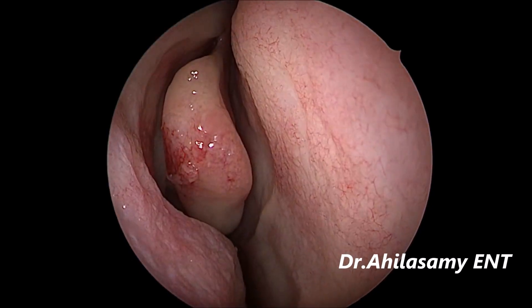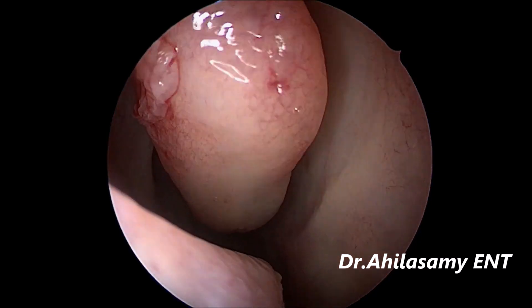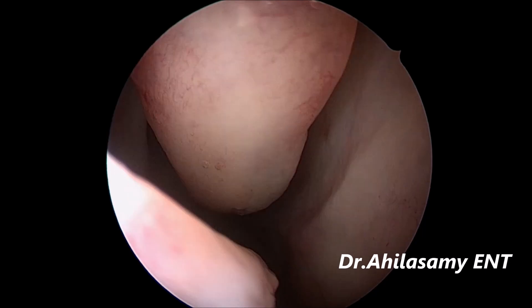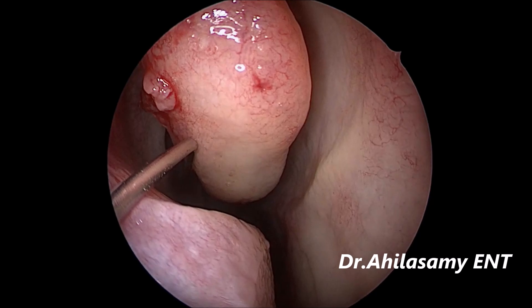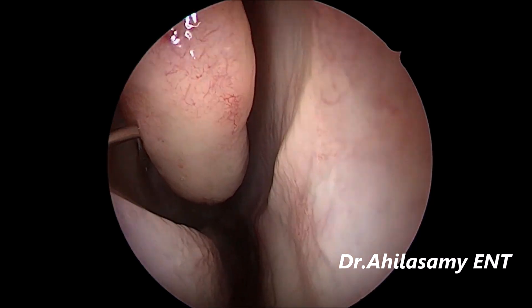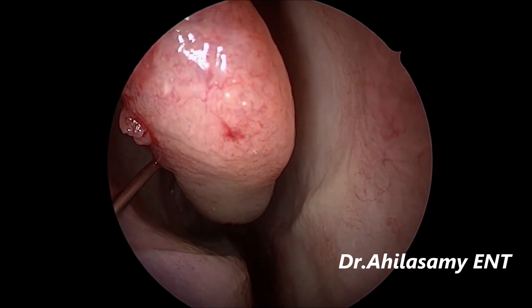See, there is blood trickling and some mucosa is disrupted. What happens? Every time you take the scope, the scope gets fogged, or this raw area will stick to the lateral wall and cause post-operative synechiae. So never injure the turbinates. Now I am giving the sphenopalatine block on the right side.